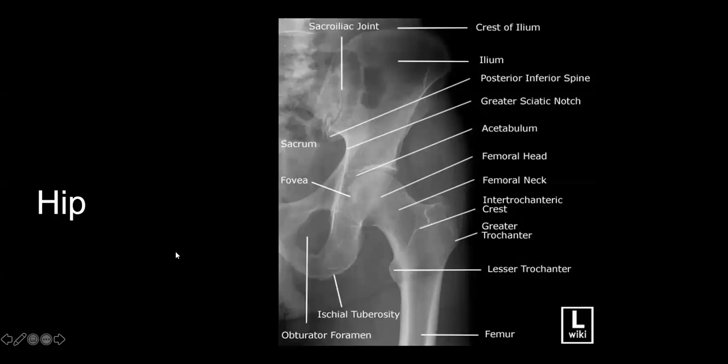So for our final joint that we're going to cover in the trauma and orthopedic section, we're going to cover the hip. Hip fractures are particularly prevalent in the winter season. As you already know, they're associated with high morbidity and mortality. And neck of femur fractures will definitely be the bread and butter of any geriatrics placement you do or surgical rotation. So it's better to get your eye in now to know what you're looking for.